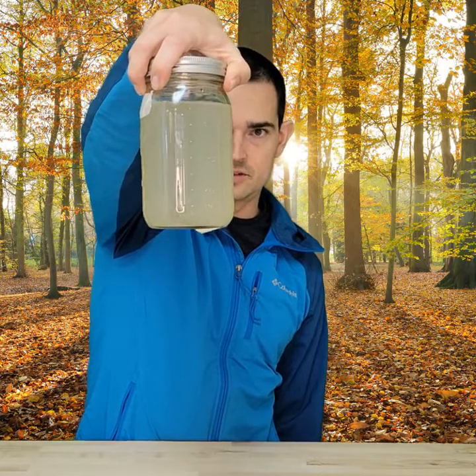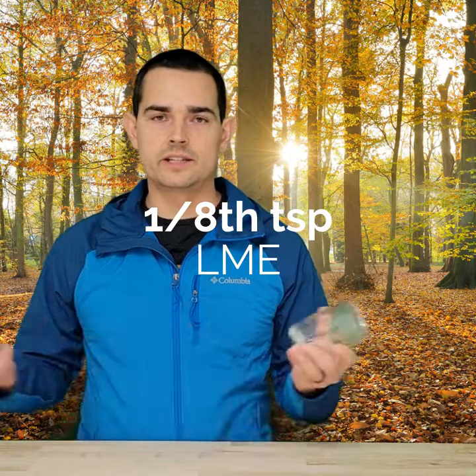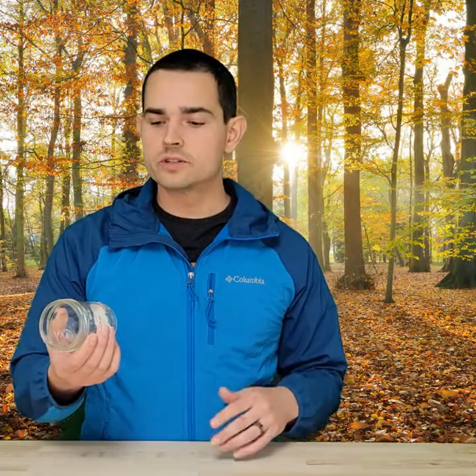Here's an empty jar. In this jar you can put about an eighth of a teaspoon of light malt extract — you can get this at any brewer shop, from our website, or you can also get any kind of mushroom culture mix found online. It's usually going to be a sugar base. You don't want too much sugar in there, because if you have too much sugar in your liquid culture, you're not going to give the mycelium much incentive to grow or span out in your jar.